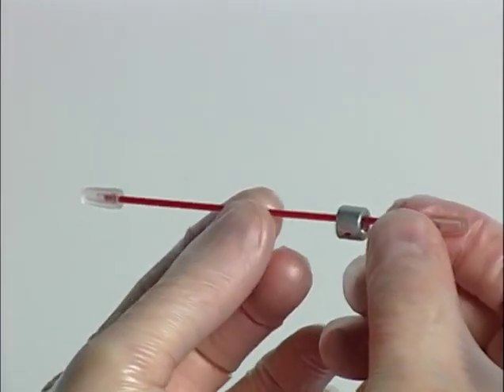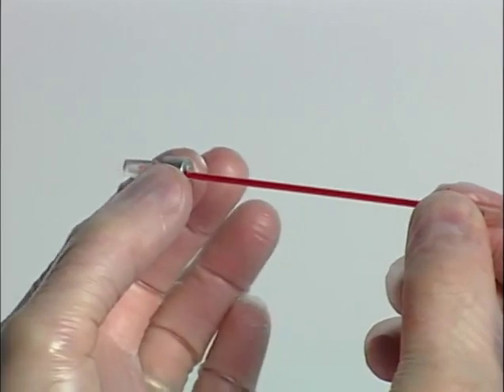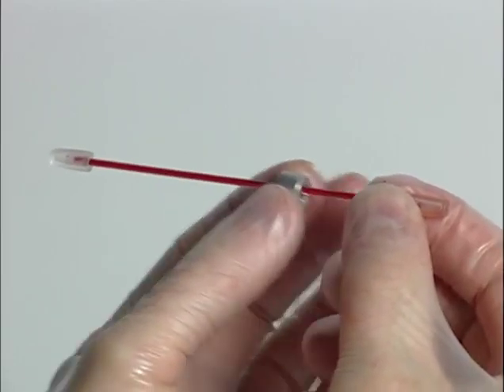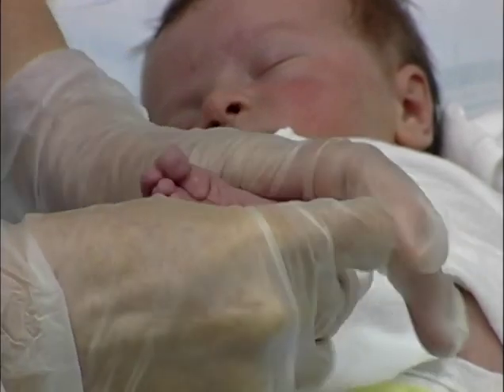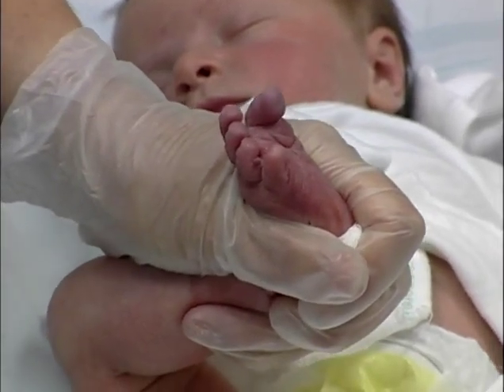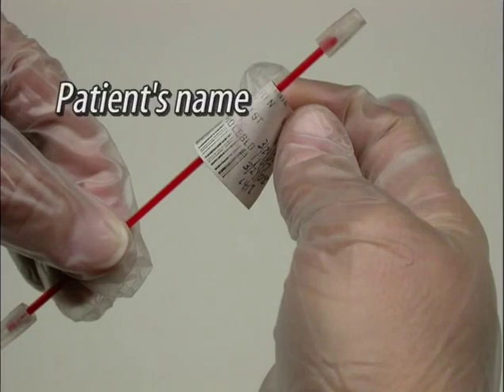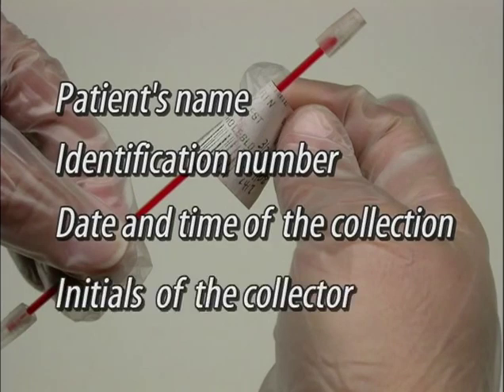Place a metal bar or flea into the open end of the tube and quickly seal it. Move the metal flea with the magnet to mix the specimen to prevent clotting. Transport the specimen at room temperature. When collection is complete, elevate the extremity and apply pressure to the puncture site using a clean gauze pad until bleeding has stopped. Never leave an inpatient or dismiss an outpatient until all specimens are labeled with the patient's name, identification number, date and time of collection, and the initials of the collector as specified in your facility's policy.